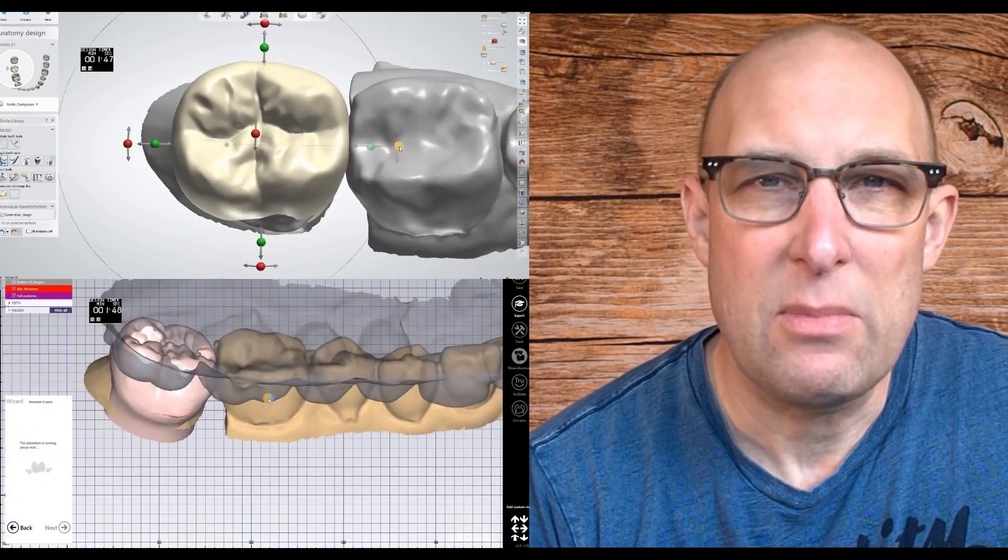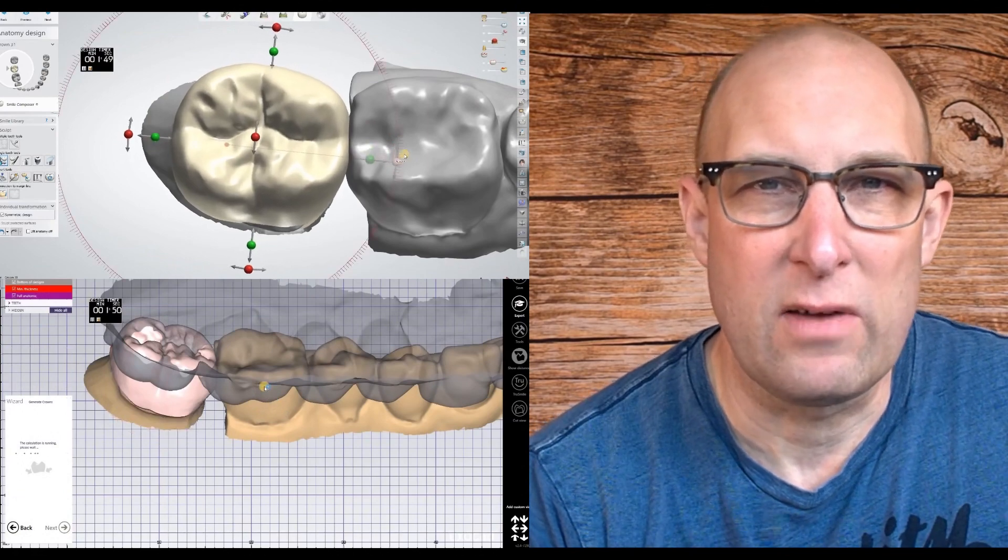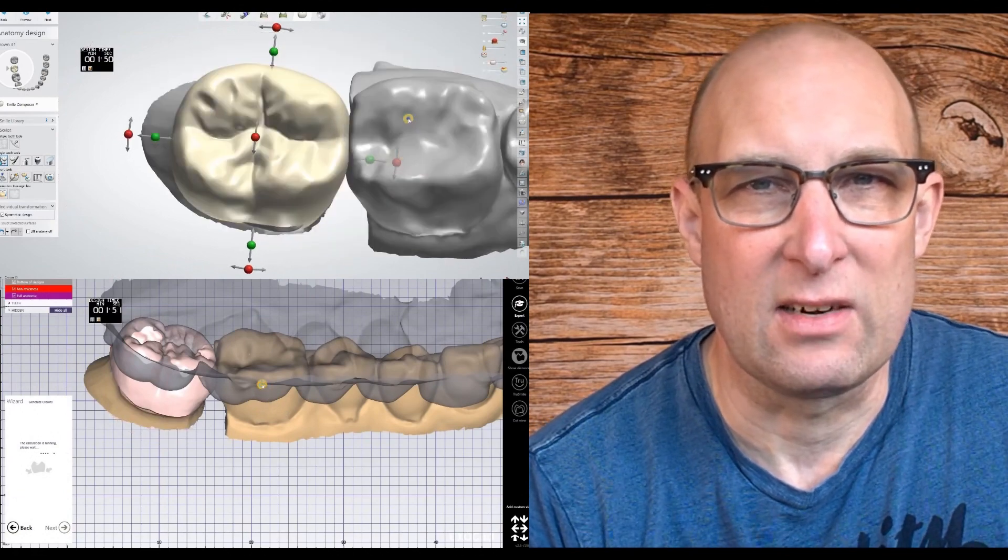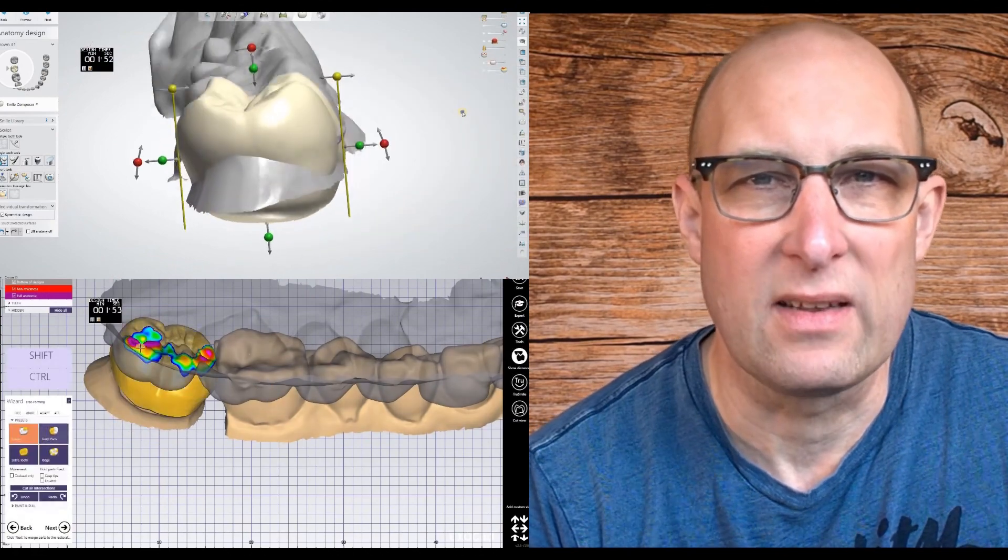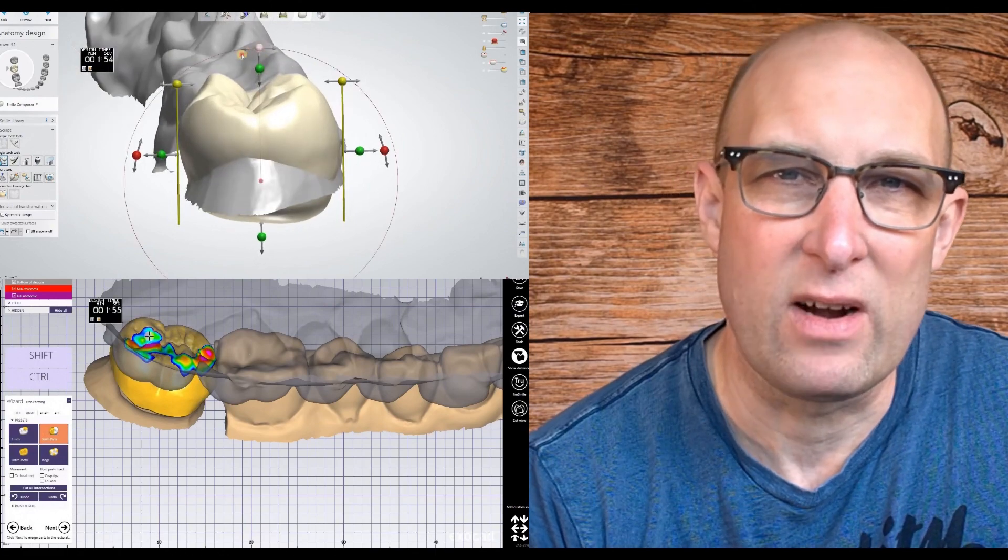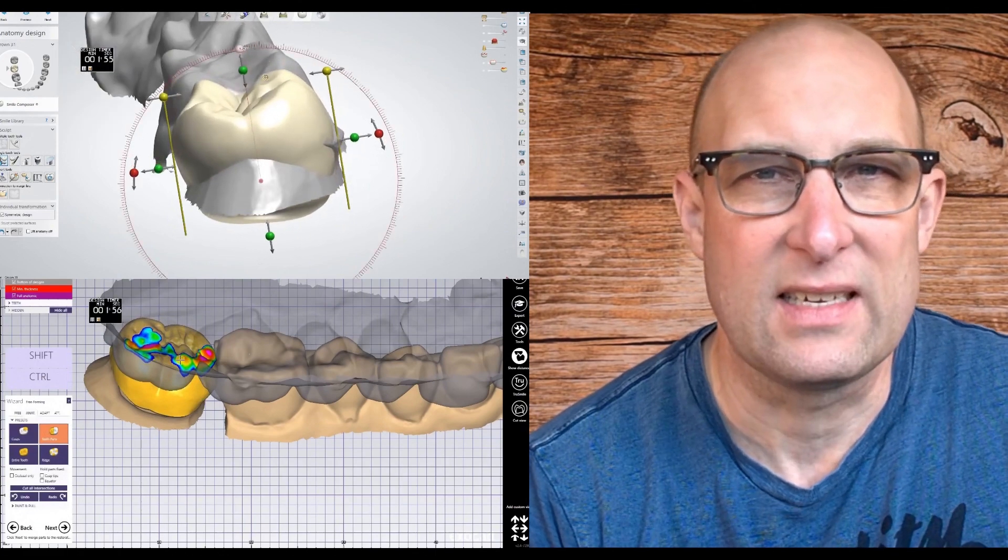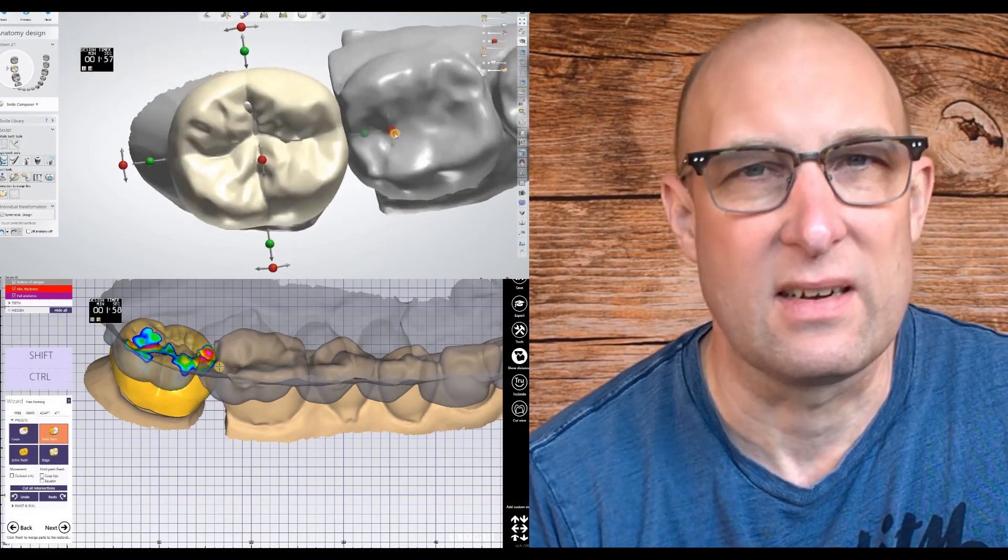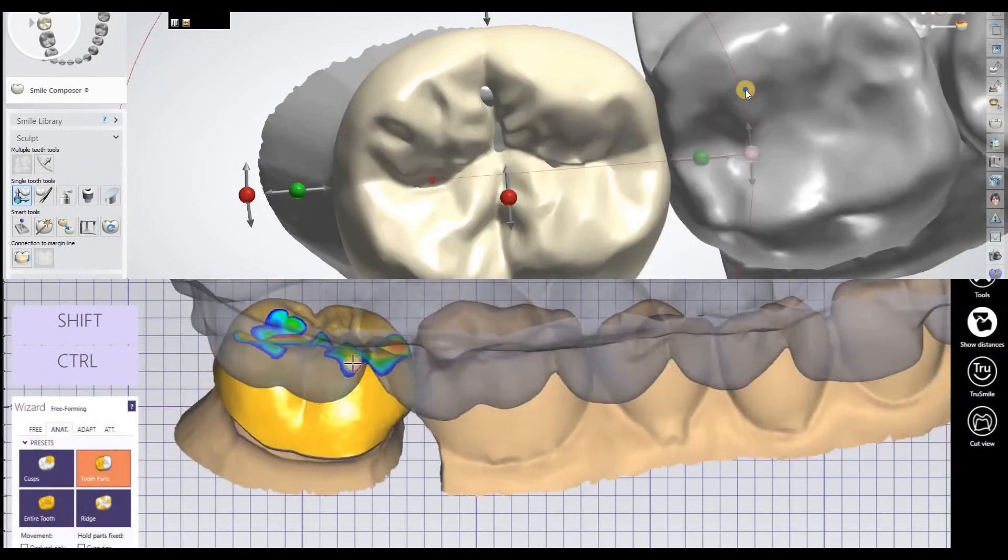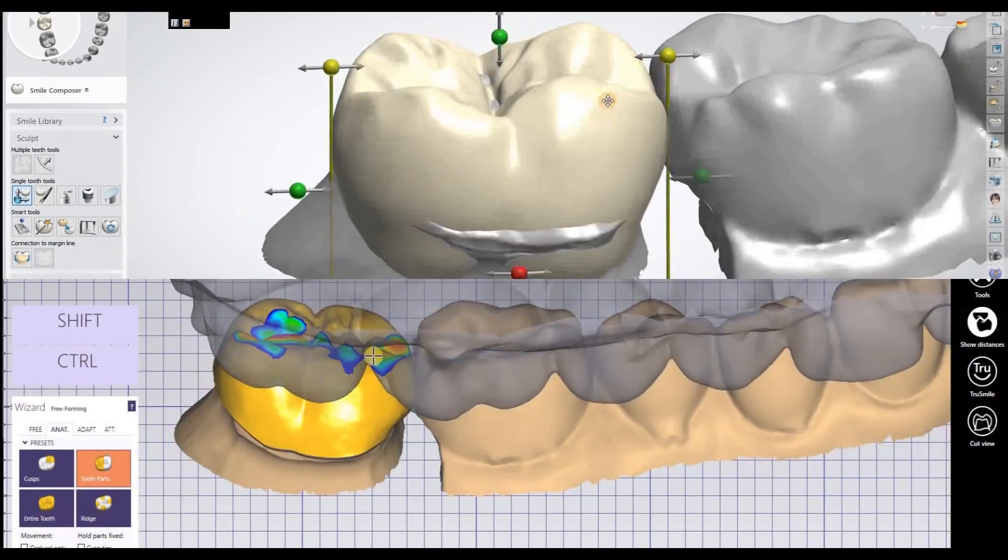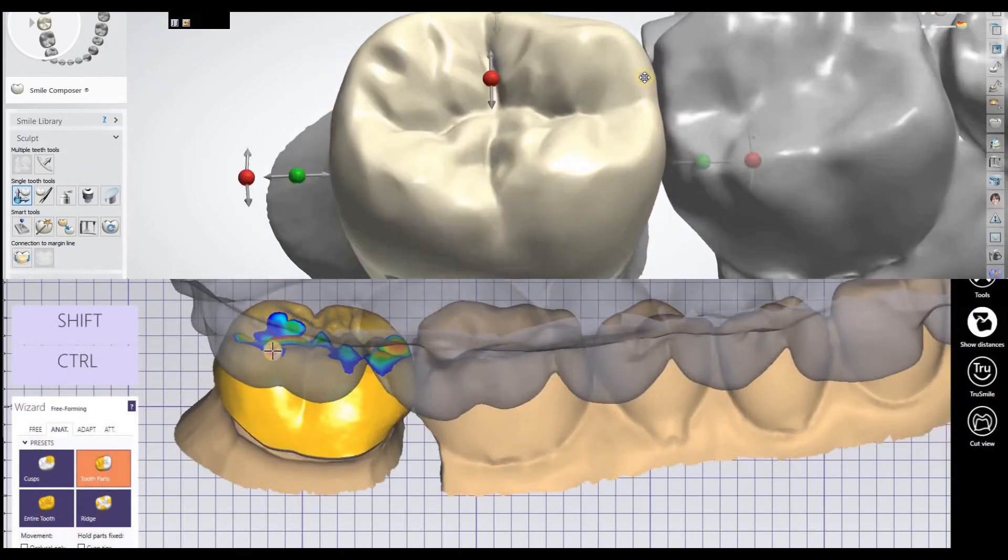In three shape, it's sometimes a little bit difficult because you have to find these little dots and position the tooth in the right area. In order to scale it where you want it, it can be difficult sometimes. What I'm going to do here now is morph the occlusal surface a little bit in exocad.